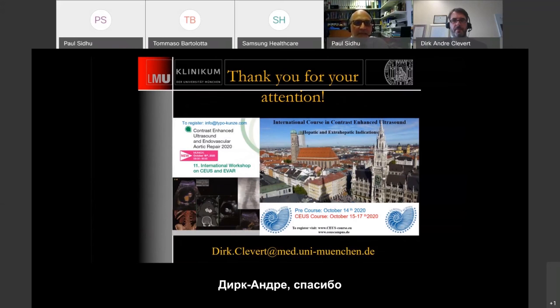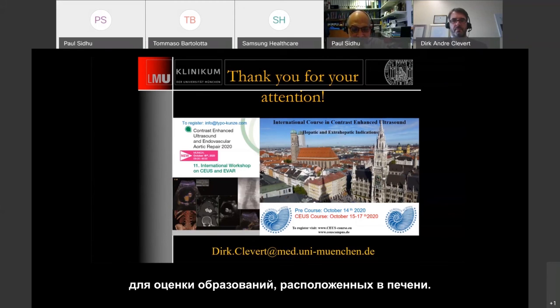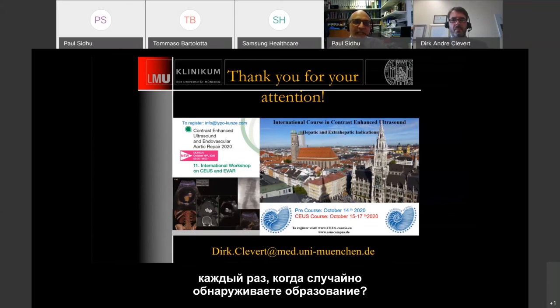Thank you, Dirk-André, for a very clear and concise representation of using contrast-enhanced ultrasound in assessing liver lesions. I've got one question, first of all, before we go on to the audience. Do you do contrast-enhanced ultrasound on every lesion that you incidentally see?